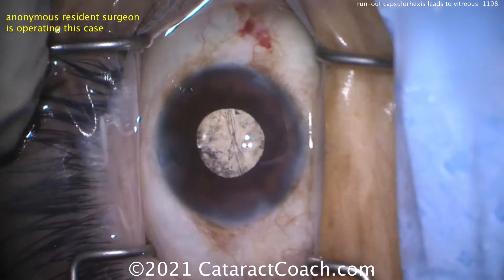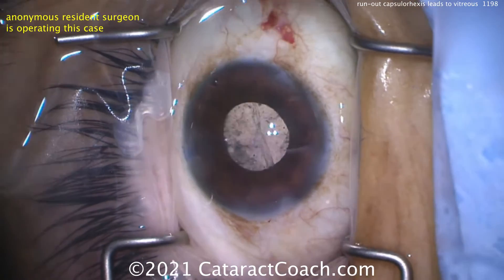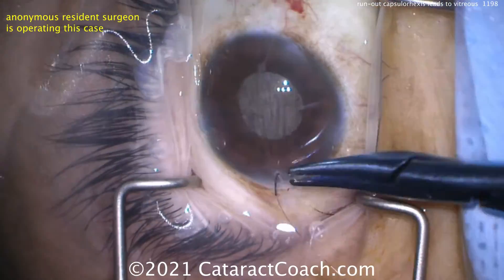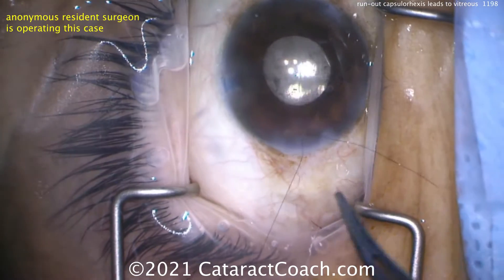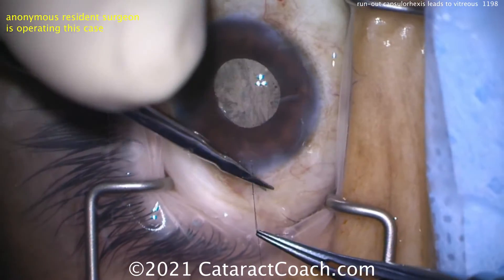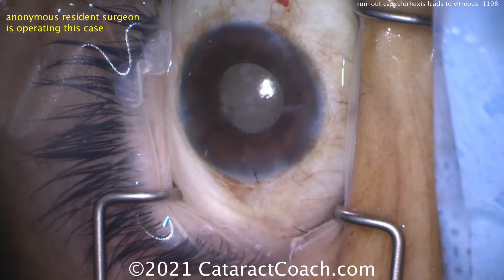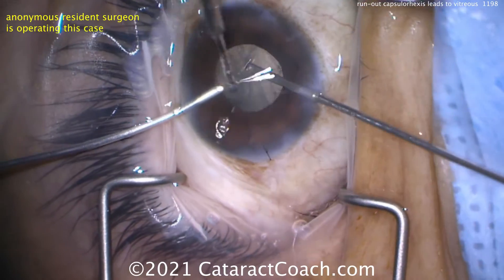Finding a good area of support and fine-tuning the adjustment and positioning of the haptics. That looks great. Now, do not leave the eye without a suture — definitely place a suture in the main incision. If there's flattening of the anterior chamber in the post-op period, you can have vitreous prolapse. Right now there's no vitreous in the anterior segment — let's keep it that way. Sealing up the other incisions and then doing a bimanual IA with the vitrector on cortex or viscoelastic removal mode through the two side ports.